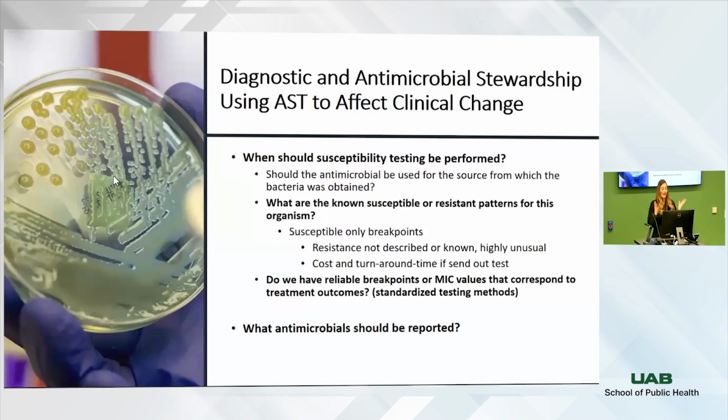So in looking at all of this combined, what antimicrobials should actually be reported out to clinicians and to clinical staff? And how are they going to act upon all that data? One, how is it going to affect the patient and patient billing? But also, how do clinicians respond to that?